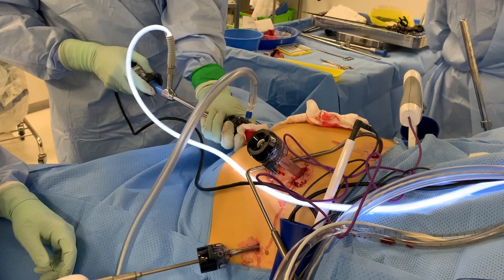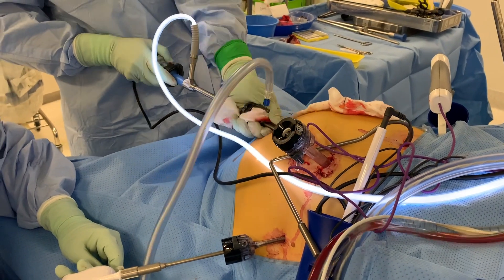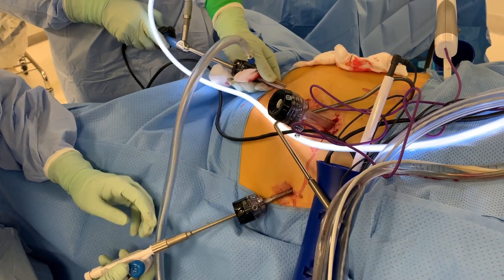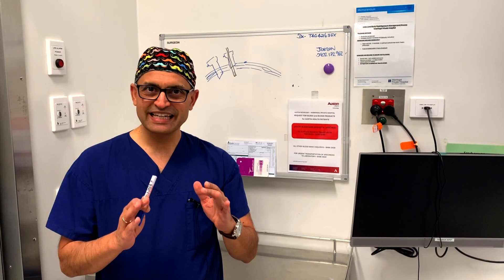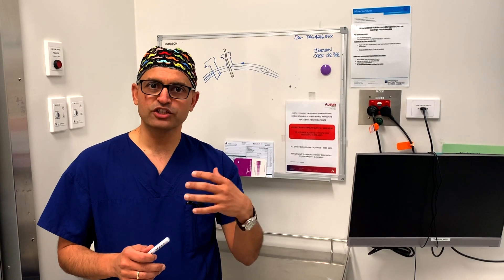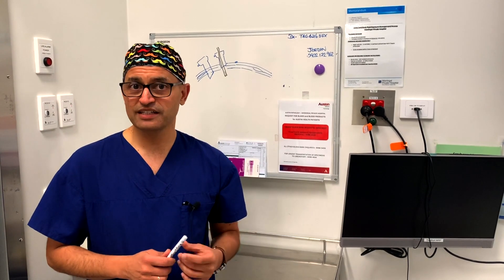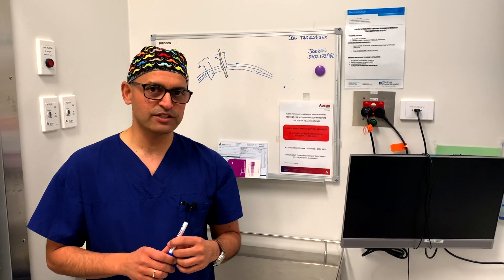One of the techniques I wish to describe here, which might be useful for laparoscopic surgeons, urologists, gynecologists, colorectal surgeons, and the likes, is a technique which is fairly simple. It's a slight modification of the equipment you are already using, does not require anything new to purchase, and it can certainly be used in emergency situations.